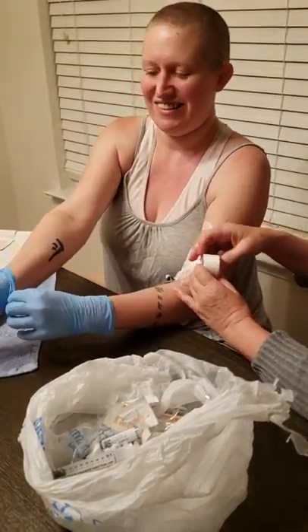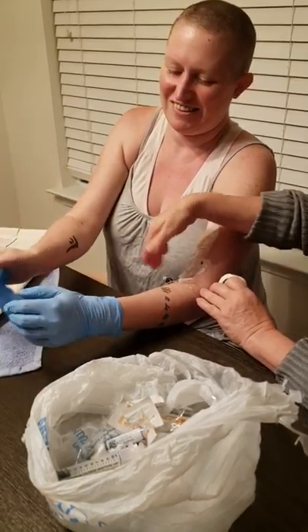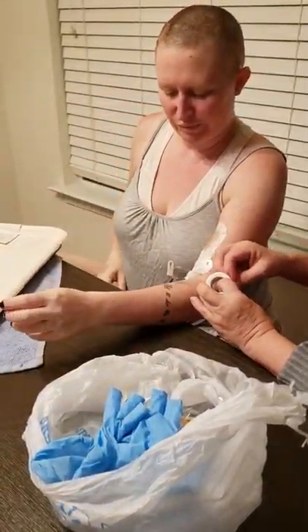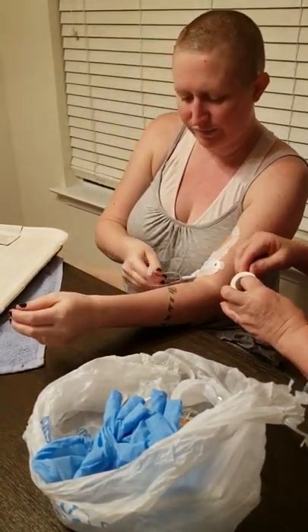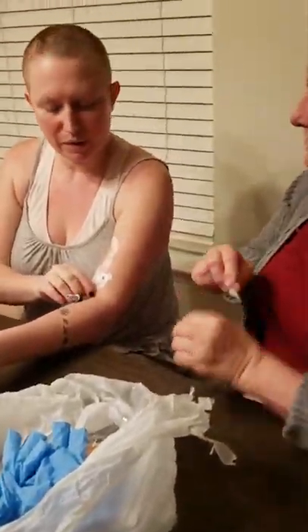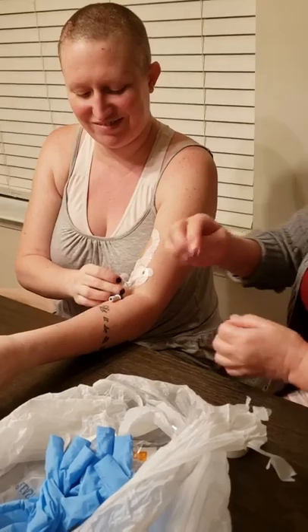The only reason for doing this is just to keep it out of her way as she lives her life. It's no longer sterile. Now that it's done, some of these have caps on the end — hers doesn't. The sterile part's over because she's going to clean that really good before we do this again. So we're almost done.